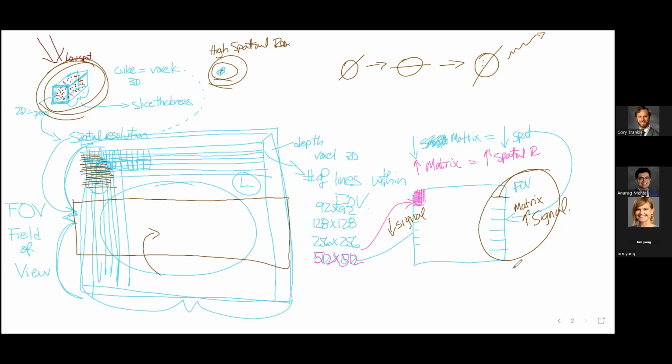Those protons are bound to carbon, primarily in fat, and oxygen in water. We're going to focus mostly on the water ones, but next week we'll talk about some differences in how we can separate the two out, carbon-bound hydrogen from oxygen-bound hydrogen.